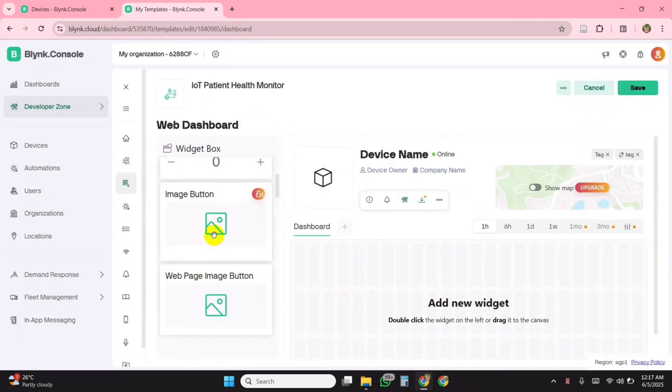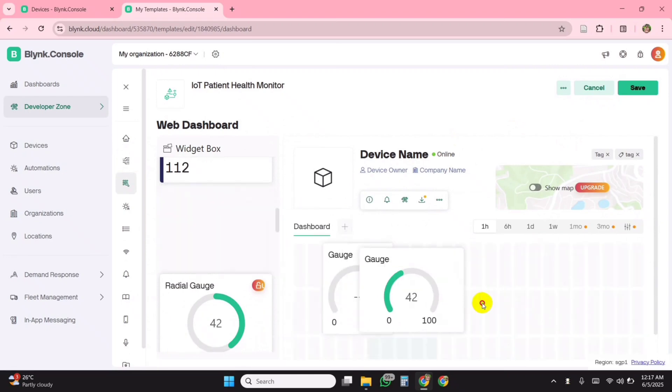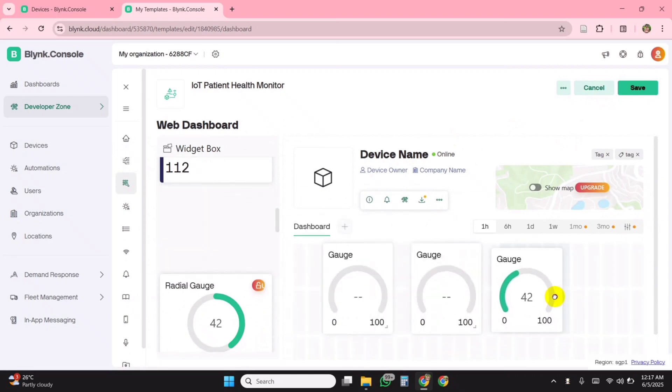On the web dashboard, add four gauge widgets and assign each of them to its corresponding virtual pins.